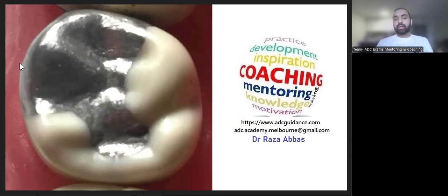So I'm going to go through certain important points, certain important tricks for this task for you to be able to cope and understand this task in a bit better way, and certain troubleshooting tips at the end as well, just to give you more clarity on how you can work your way out on having a clinically satisfactory restoration, and also a restoration that fits into the ADC marking rubric, because that's the most important thing. ADC marking rubrics is the most important thing. Any task that you do should be fitting the ADC marking rubric, all right?